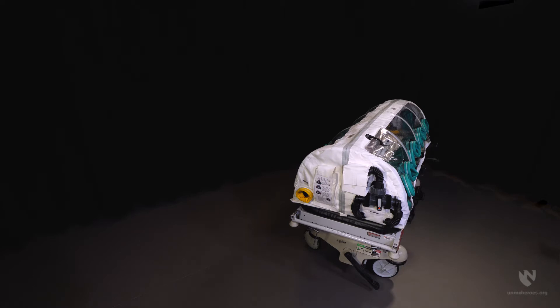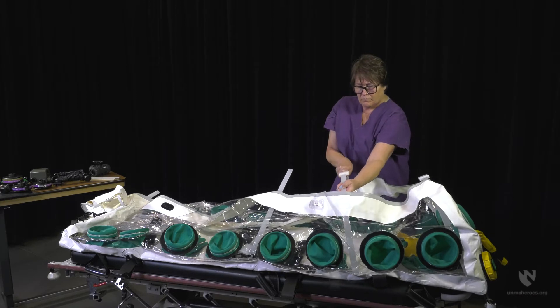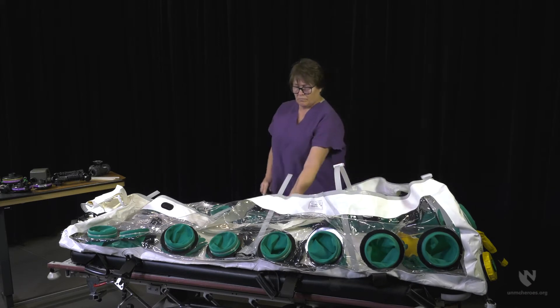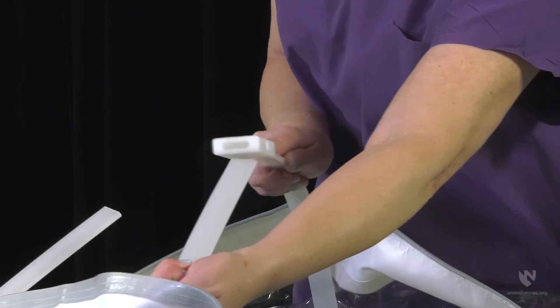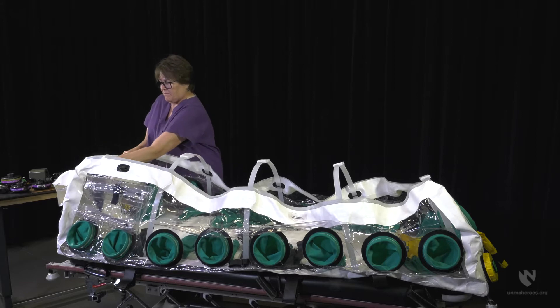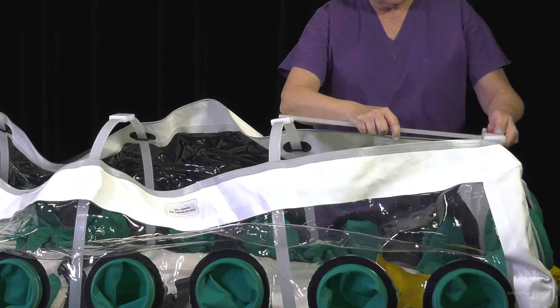Careful assembly of the ChemBio isopod is warranted to ensure proper function of the device. Beginning with the enclosure open, assemble the ribs by connecting the rib buckles. Insert the spine segments into the receptacle on each rib buckle.